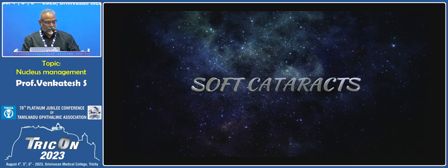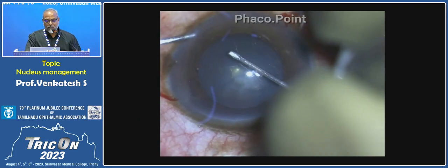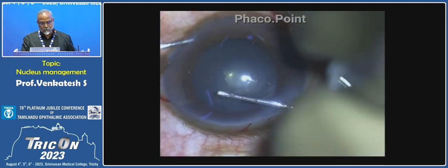And we start with soft cataracts. All of you know that soft cataracts are probably the most difficult types of cataract to handle because of cheese wiring and crater formation that occurs every time you employ the phaco power.